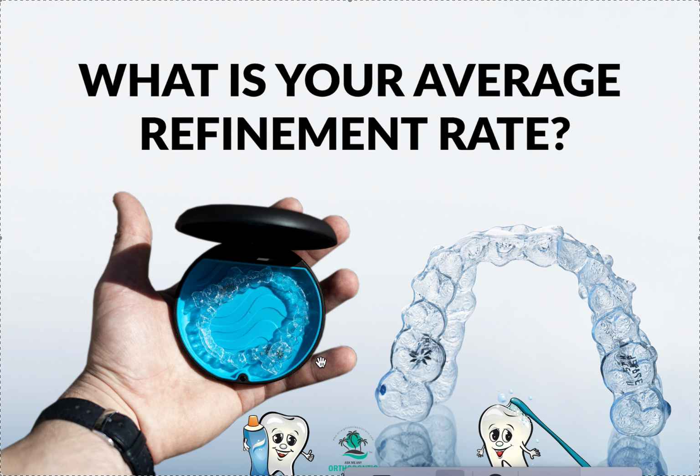On ClearCorrect, I do 3 times, okay? Because theirs is so fast and ridiculous. It's not even healthy for the teeth and gums and bone, in my opinion, okay? As an orthodontist, I know what movement is healthy and stable, and what's more likely to damage bone, gums, teeth, roots, and cause tipping instead of translation, okay?